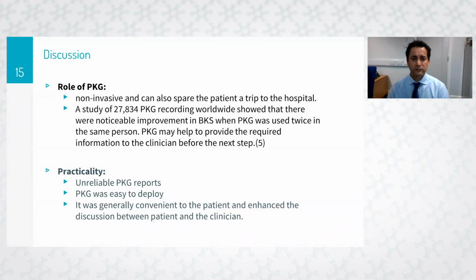Now, it is a non-invasive kind of technique, and the patients usually like it. It can be done as we did, where the patient lives. So somebody goes out and applies the machine or the watch to them, or they can also have it done during a clinic visit as well. You can have a contract where you will be given the watches and the iPads, and you apply the watch to them, they go home, and then they drop it off 6 days later.